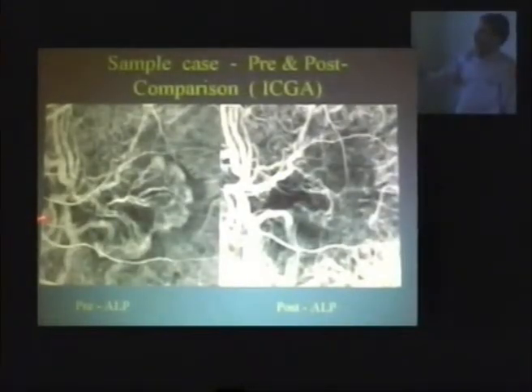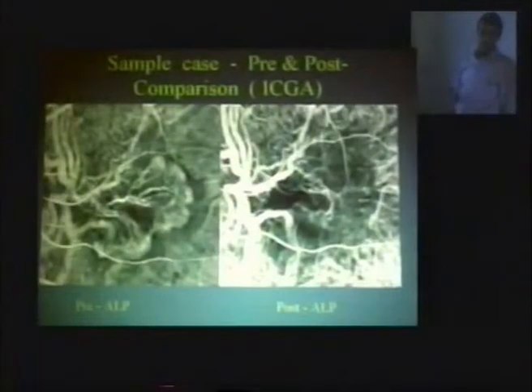Now, how do we find it? Okay, I go up to this good example. Can we turn the lights up for a second? This is before treatment. This is an easy case because we have clear retinal landmarks. This is the PMB here. That is one vessel, a retina vessel. 3 big retina vessels, maybe 4, that I can use for landmarks.